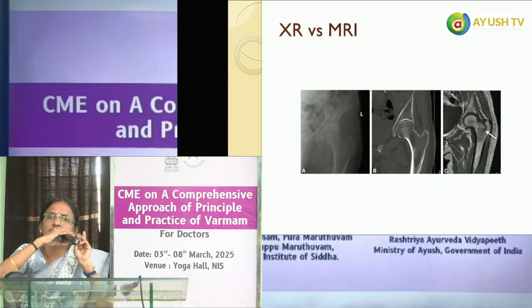Even after CT and X-ray, the patient still needs us to decide what we are missing. So we did an MRI scan. Normally in MRI we use the word intensity. Uniform intensity; this is called intensity change. So only the altered area looks black. That correlates with bone edema. The rest of the femur has uniform intensity. Only at the place the arrow is pointing there is a change. That is called bone edema. So this bone edema indirectly means this patient has a fracture in the area of the femur neck. So this is the advantage of MRI.